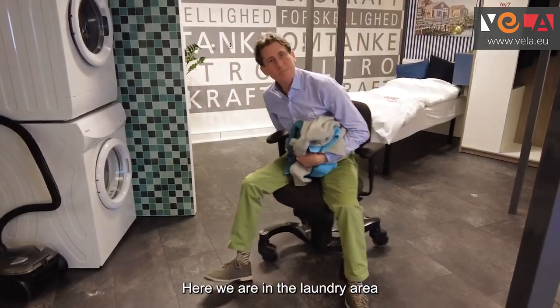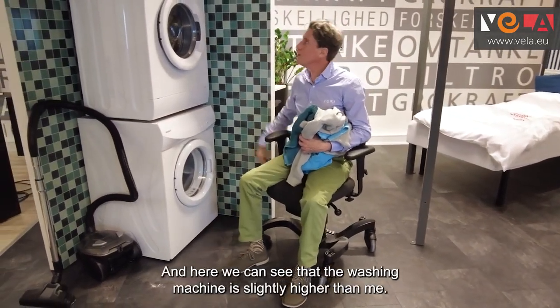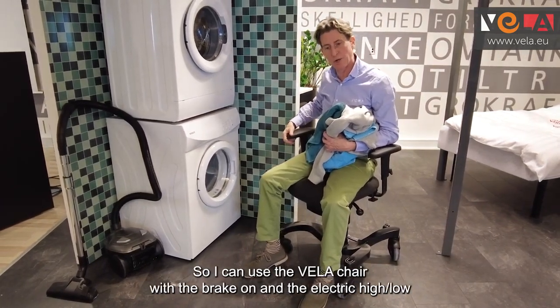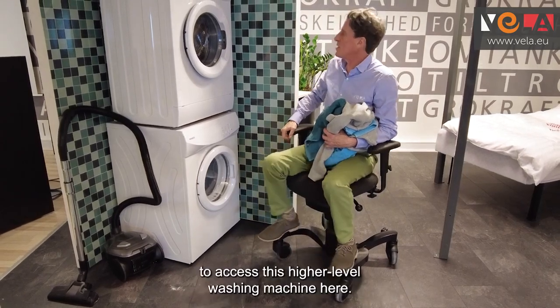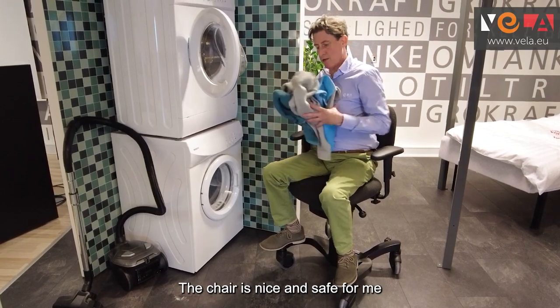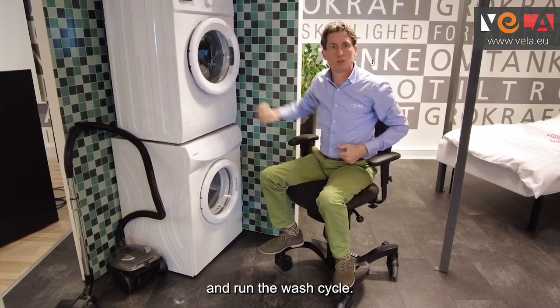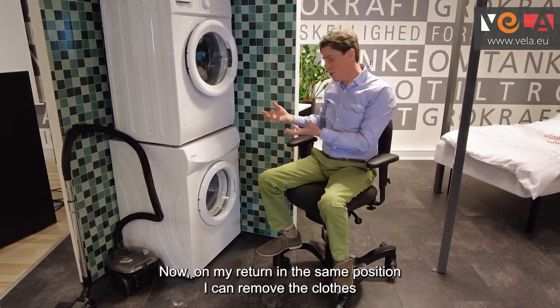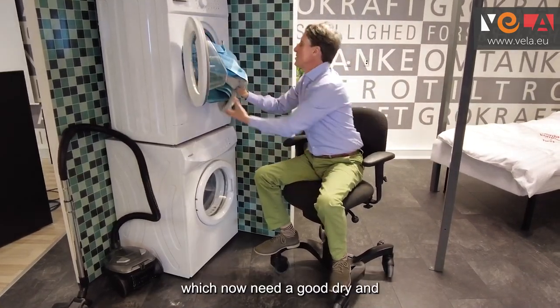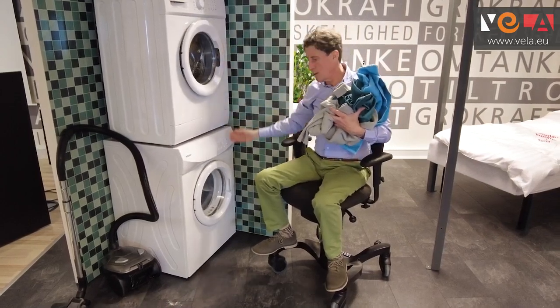Here we are in the laundry area — we all need to keep our clothes nice and clean. The washing machine is slightly higher than me, so I can use the Vela chair with the brake on and the electric high-low to access this higher level washing machine. The chair is nice and safe for me to pop those clothes in and run the wash cycle. On my return I can remove the clothes which now need a good dry, and my tumble dryer is below.